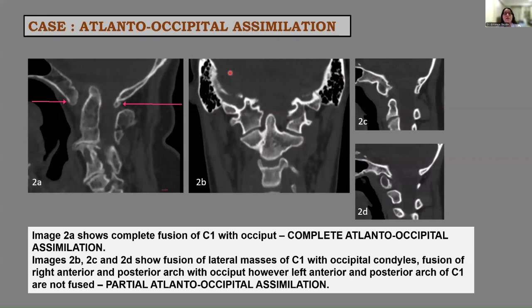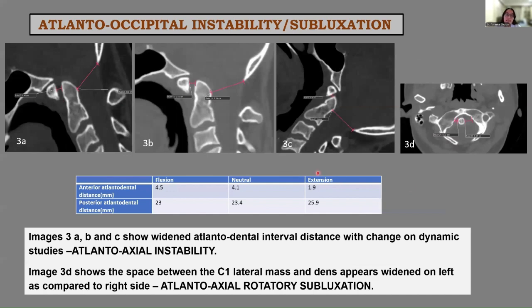This is a case of atlanto-occipital assimilation. Image 2A shows complete fusion of C1 with the occiput, suggestive of complete atlanto-occipital assimilation. Images 2B, 2C, and 2D show fusion of lateral masses of C1 with the occipital condyles and fusion of the right anterior and posterior arch with the occiput. However, there is no fusion of the left anterior and posterior arches of C1, suggestive of partial atlanto-occipital assimilation.